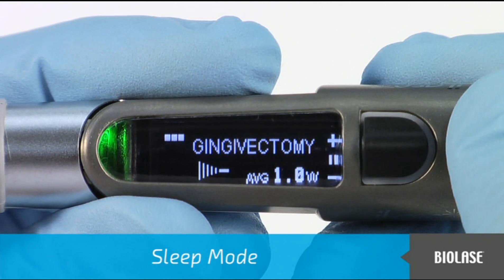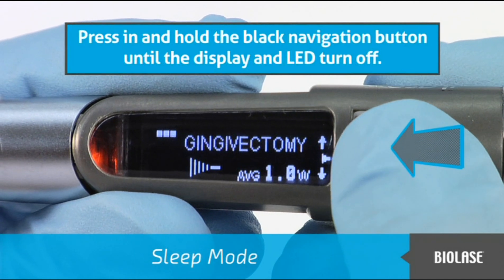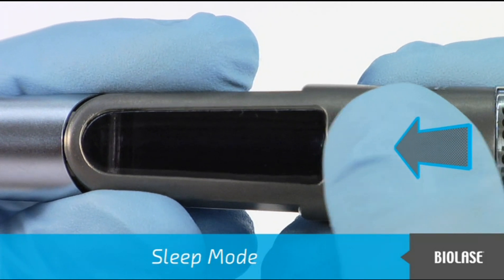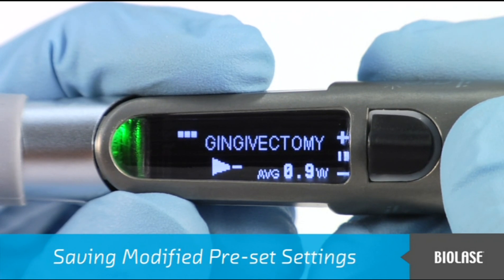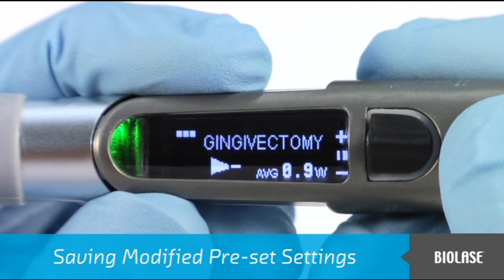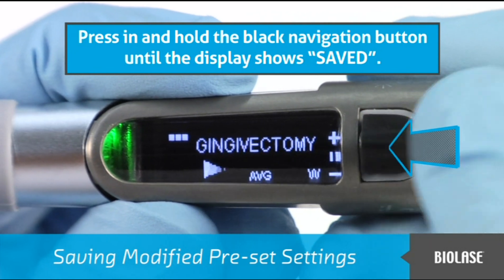To enter sleep mode, first place the iLaze into standby mode as indicated by the orange LED, then press in and hold the black navigation button until the display and LED turn off. To go back into standby mode, simply press in the navigation button. If you have changed the power or pulse mode of a preset and would like to save the values, first make sure you are in ready mode as indicated by the green LED, then press in and hold the black navigation button until the display shows 'Saved.'